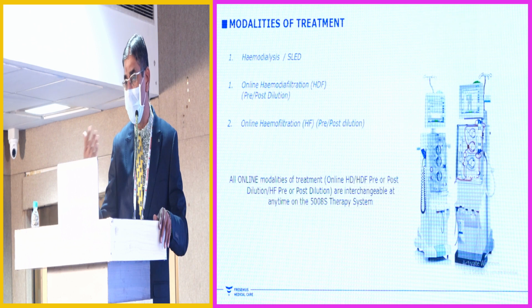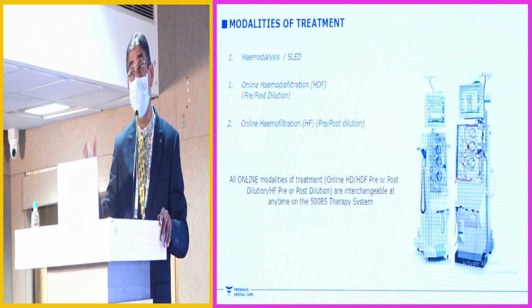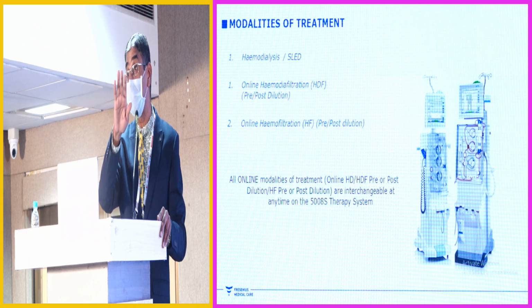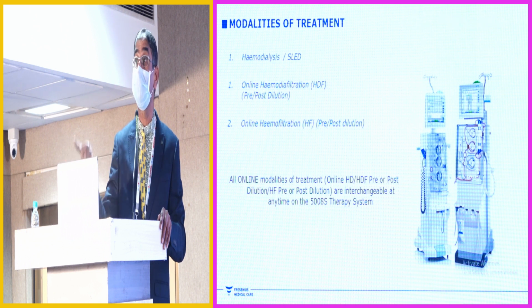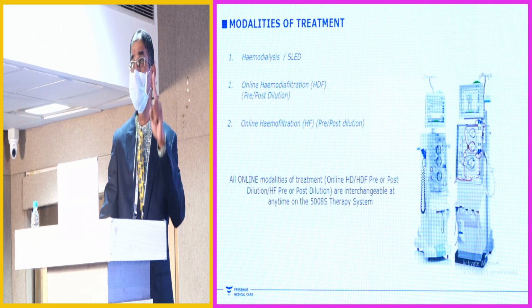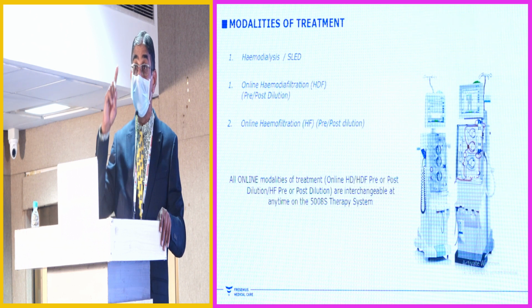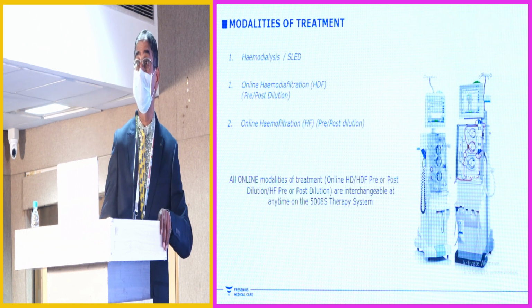I have been doing this for the last almost 18 years with this machine. From 2004, I was abroad. I have been playing with this machine, even in ICU setup. For your information, it is not the imported RO system, it is just a RO system. The only thing, one dedicated healthcare provider inside the RO system maintains it every 4th hourly and corrects things, and also disinfects the pipelines with the right disinfection and the right disinfection time.